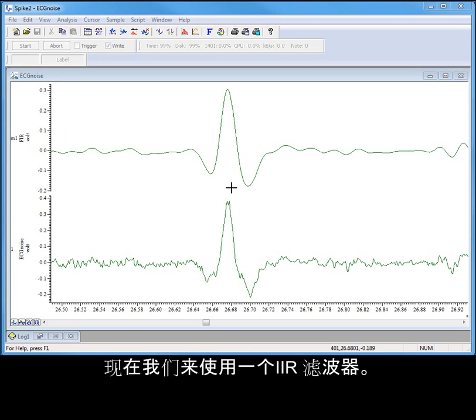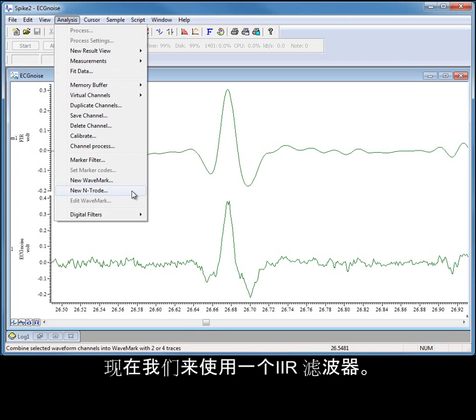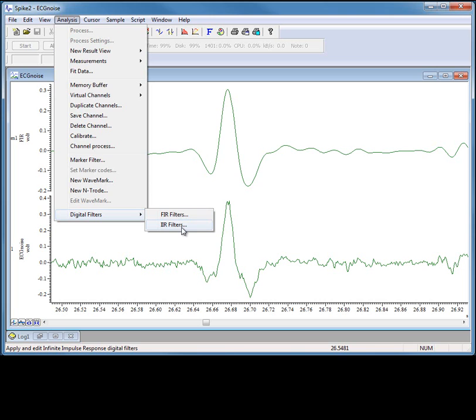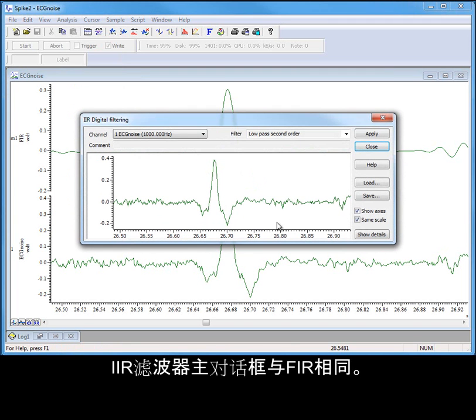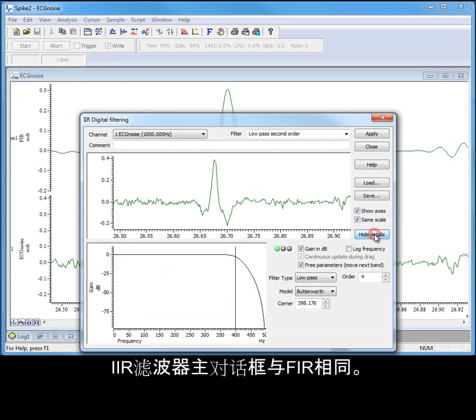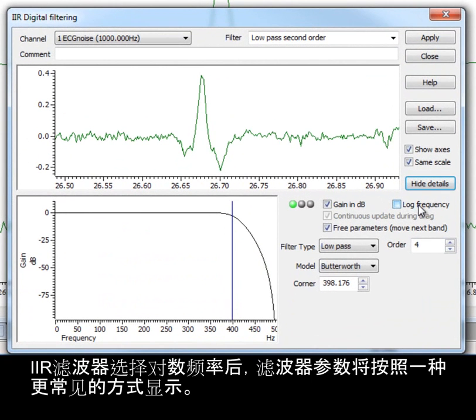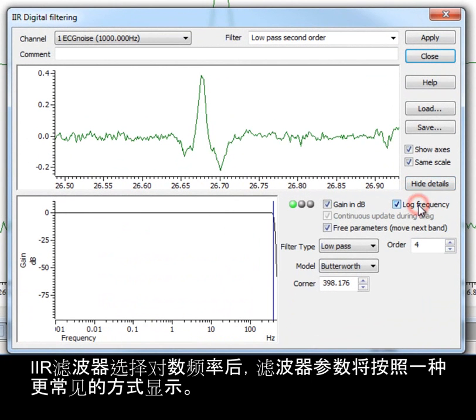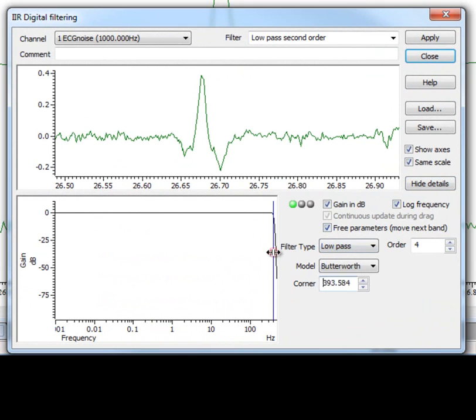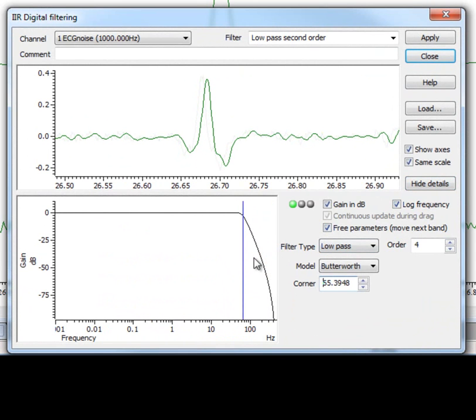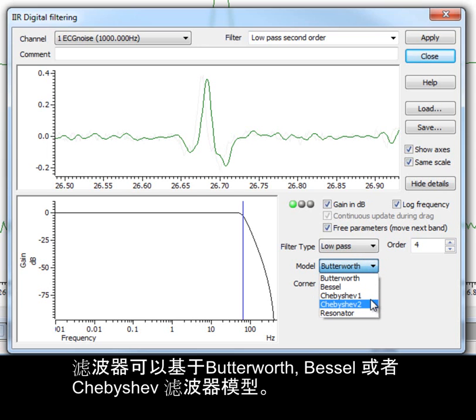Now let's apply an IIR filter. The main IIR filter dialog is the same in appearance as the FIR. Selecting log frequency for IIR filters displays the filter characteristics in a more common form. Filters can be based on Butterworth, Bessel or Chebyshev filter models.